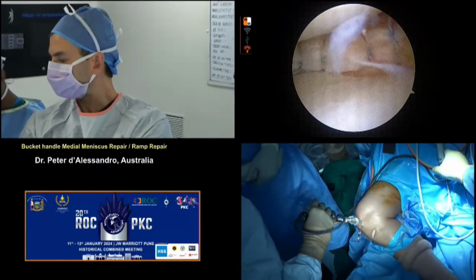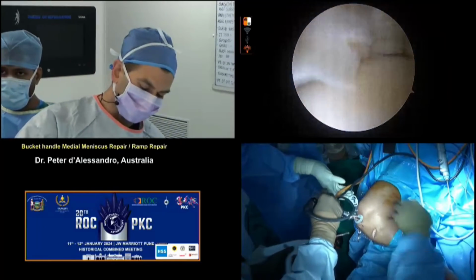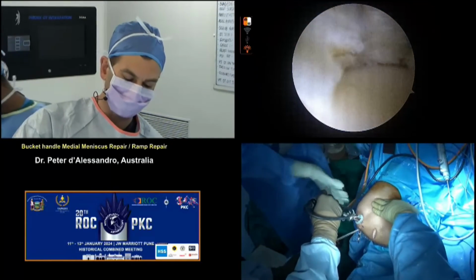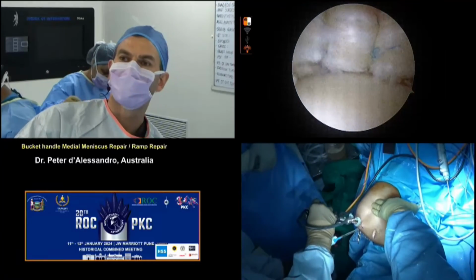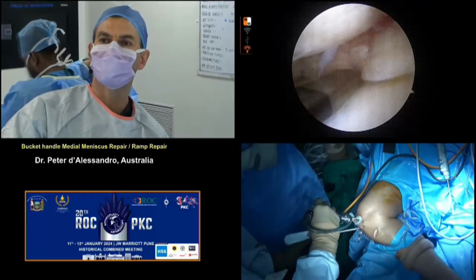We'll get the Nova Stitch. Things like removing the side support, hugely advantageous, to improving that access. That 5 or 10 degrees is often what you need to improve that access.